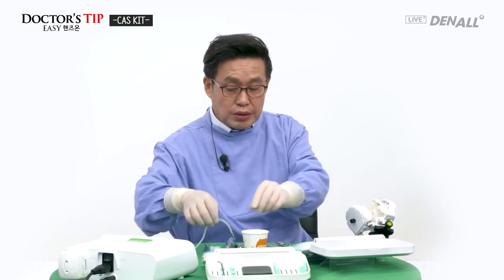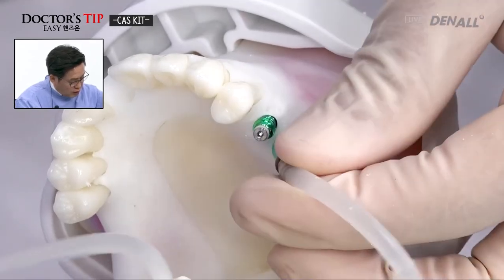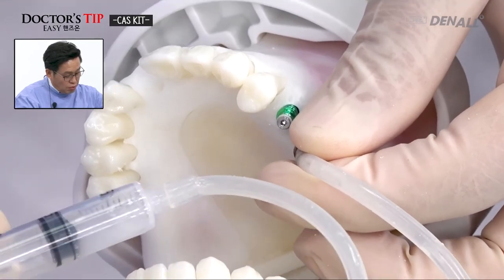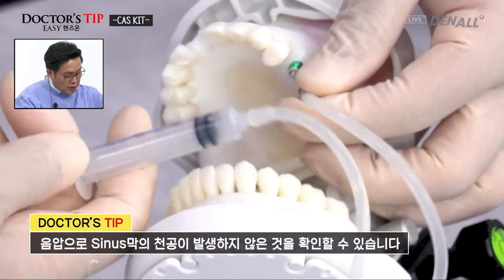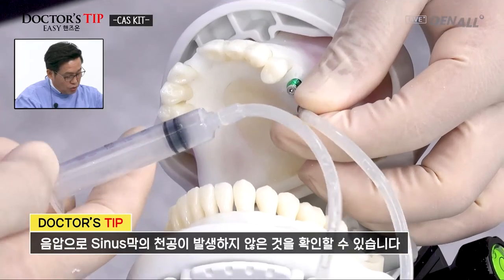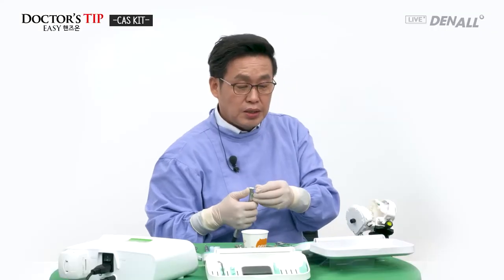In this case, as I explained, the hydraulic lifter is connected and aspiration is done. The water and bone materials are coming down due to negative pressure. It cannot be suctioned very freely. Perforation is not made, as you can see here.